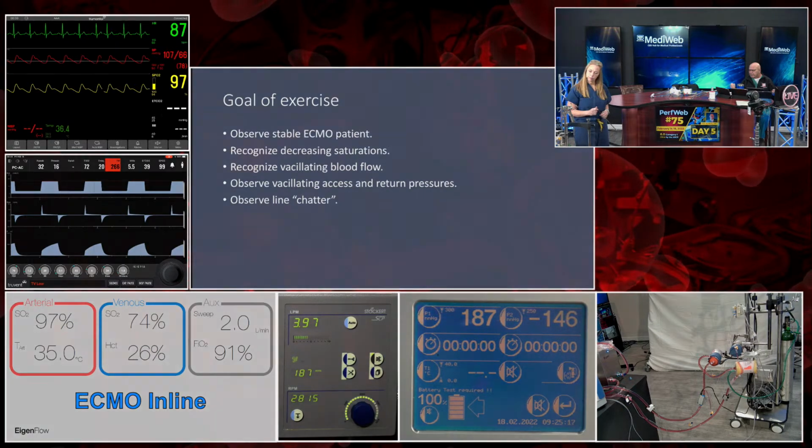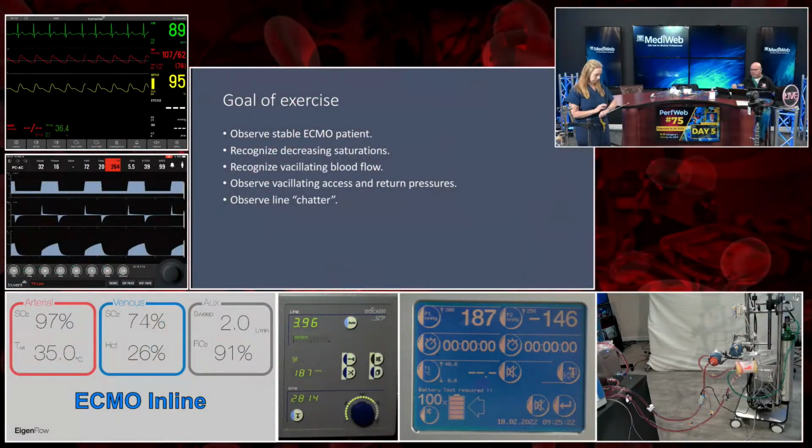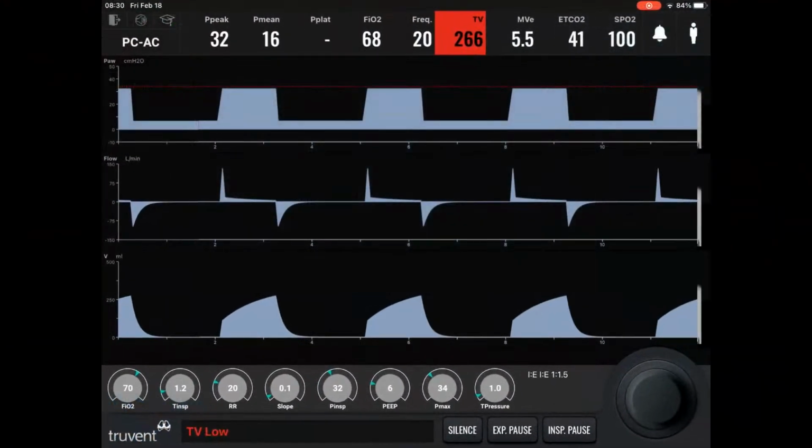No, that's the monitor, the ventilator. Sorry, my mistake. You can see here that you're at 70. You could have gone to 100%, and certainly that would have been a prudent thing to do. But at the end of the day, you're already stressed out on your vent. You're getting as much as you possibly can, and it's probably not contributing a whole lot. I would say to just go ahead and bump it to 100% for a minute as you get your volume in. But volume is the right solution to this problem.